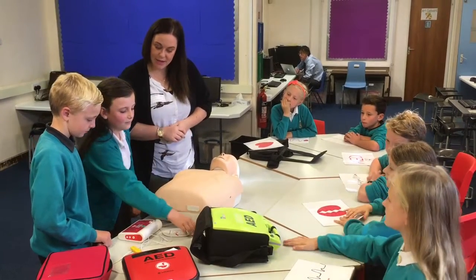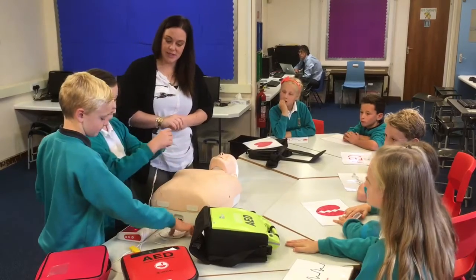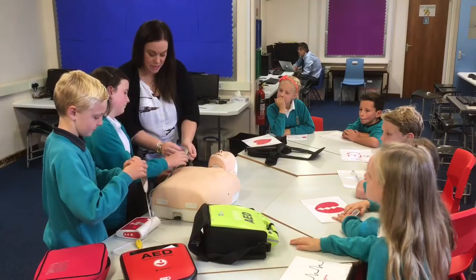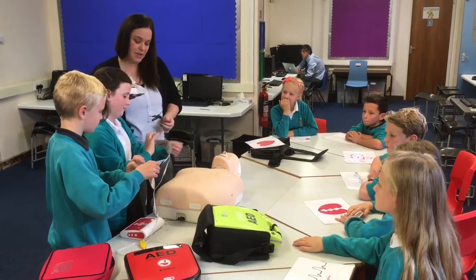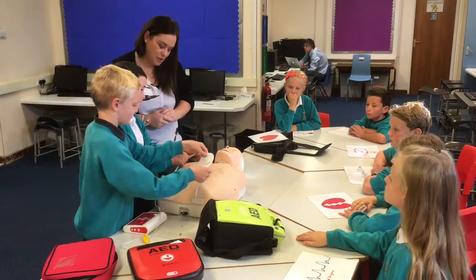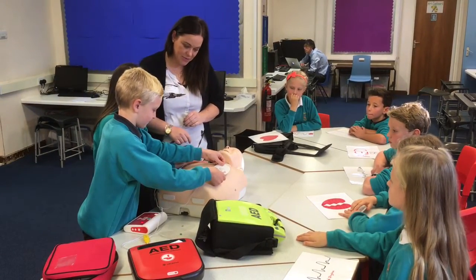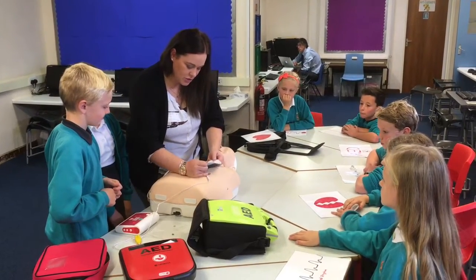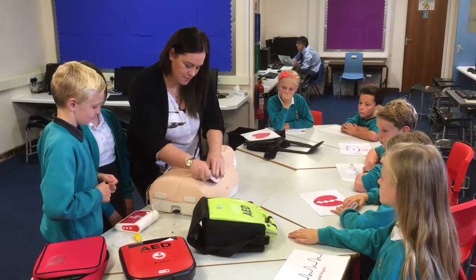You need to get the pads on. You look at your picture on the pad and you place it where it needs to go. You take the sticky off the back and it won't move on to the next stage until you've done the first one. So you pop the pad where it says. Just a little bit further down. Apply pad, plug-in connector.